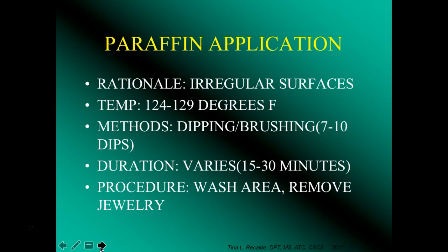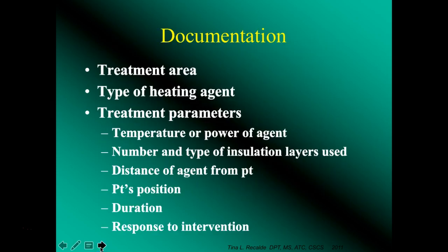There's different methods. We have the dipping, or you have a brushing. With dipping, we do anywhere from 7 to 10 dips. The duration varies between 15 and 30 minutes. The procedure: you want to wash the area that you're going to do the paraffin on. You want to check for any open sores, make sure they have good sensation, and remove any jewelry. That jewelry will heat up.